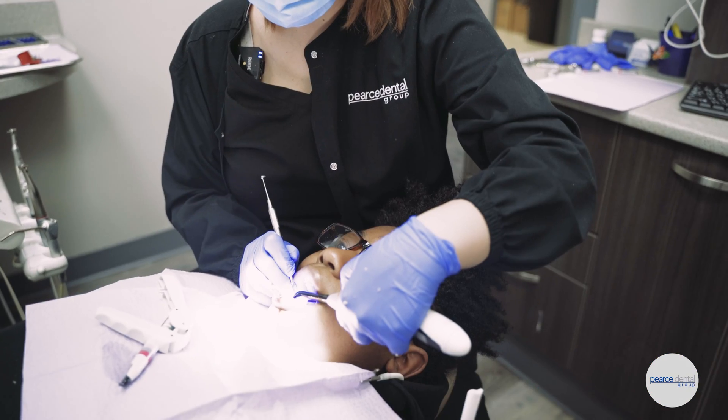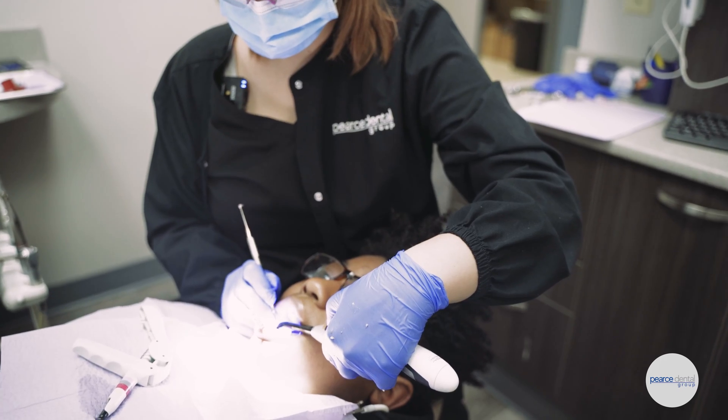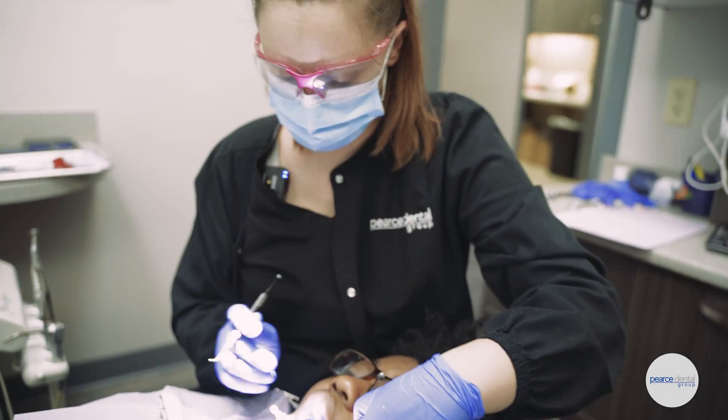When we take x-rays for your cleanings, what we look for is anything in between the teeth, because we can only see so much with our eyes during our exam and there's a lot of tooth structure that goes missed.